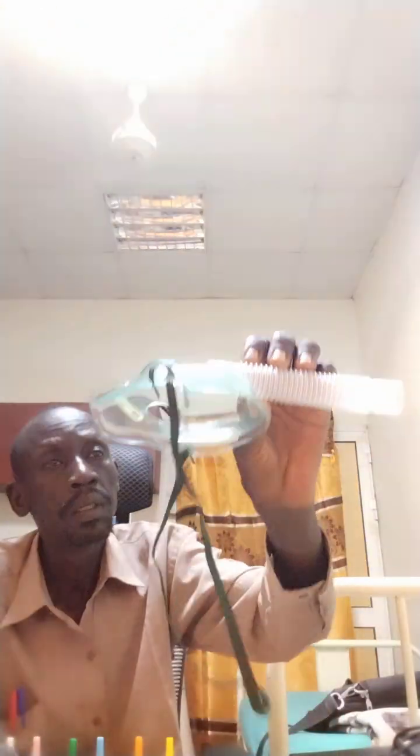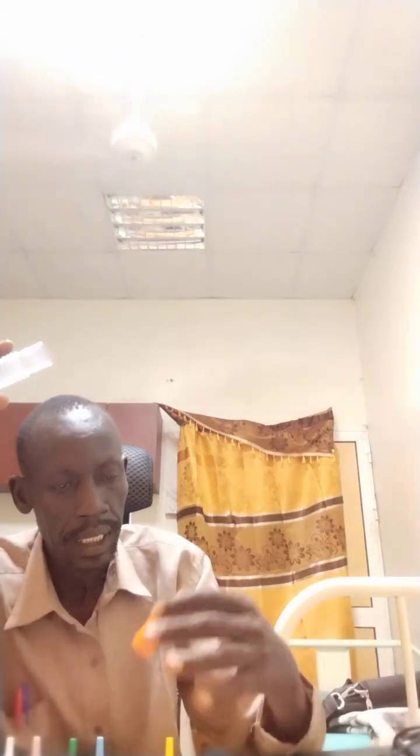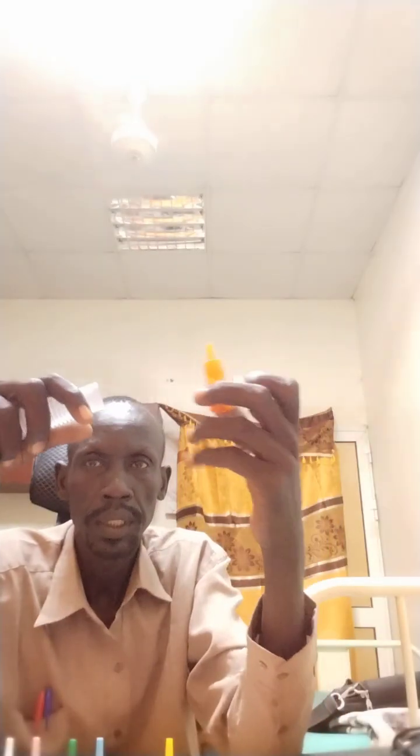Now, the first thing I do is to fix the mask with this corrugated tube. Then I decide I want to give my patient an FiO2 of, say, 50%. This one gives 50%. So I fix it here.